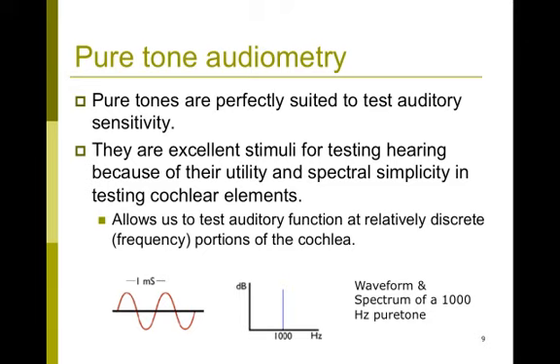And pure tones are perfectly suited for hearing assessment because they're spectrally simple and we are specifically targeting a certain frequency. These are examples of waveforms of a pure tone and a spectrum of a pure tone. So you can see that there's no energy in any other frequency, and that's the reason why they call them pure tones.